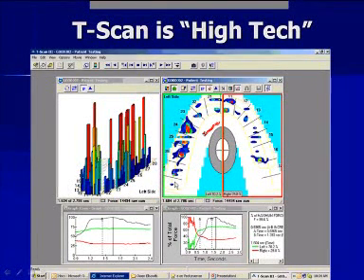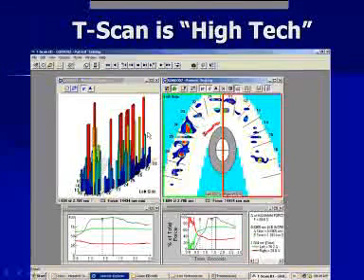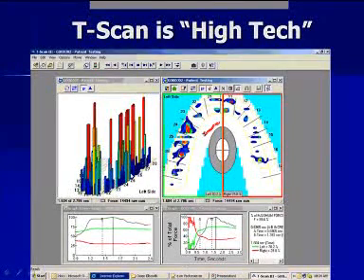For instance, here I'd say, well, you've got 70% of the forces on the left and only 30% on the right. So right there, that tells us that your bite is not balanced, and we can see breakdown already starting. It would be really a good idea if you came in for a further assessment, so that the doctor can decide what can be done about the fact that you've got 70-30.